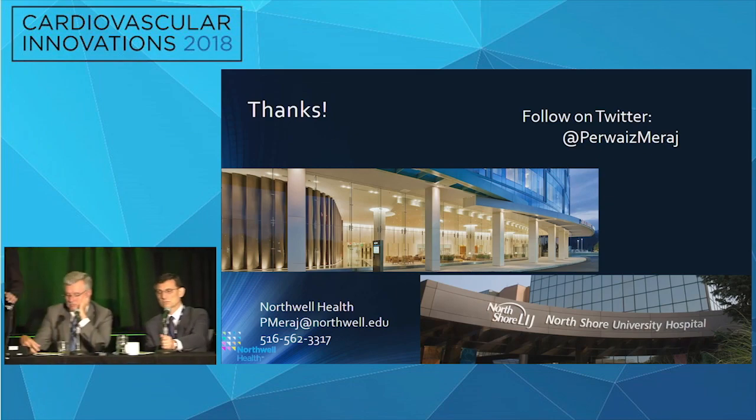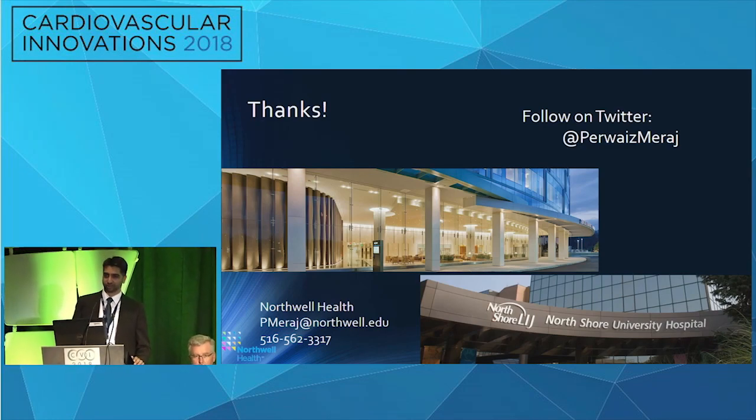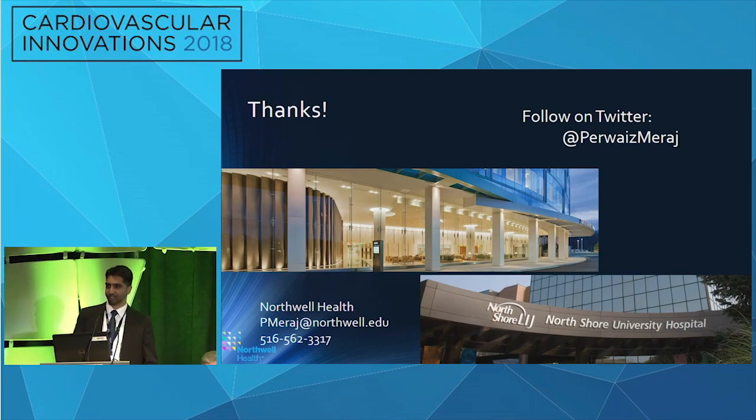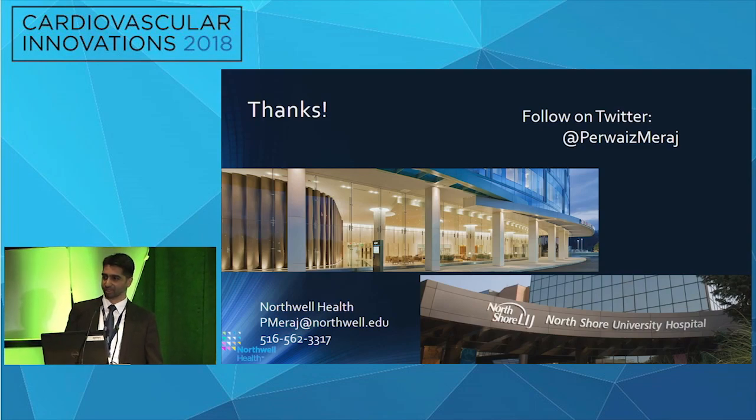We do a lot of mechanical support for our high-risk complex cases, but I'll tell you, the cases that are the most fruitful for using mechanical support are those atherectomy cases. Atherectomy is a complex beast that's beyond just regular PCI. You can honestly probably get away with a left main that has a low EF without atherectomy more easily than you will if you use atherectomy and try to not use support. There is something that atherectomy does to whatever remaining reserve you have in those low EF patients that doesn't make them happy. Without hemodynamic support, in my opinion, if you have a low EF, heart failure or shock type of patient, and you have to use atherectomy, it's a no-brainer. There's no reason to not use mechanical support in that kind of case.